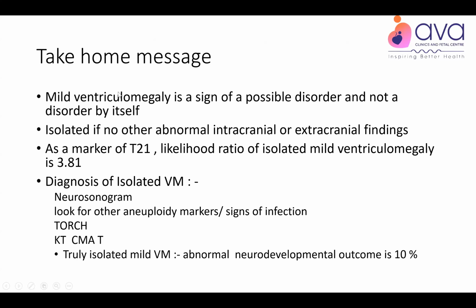So the take-home message from these two cases is that mild ventriculomegaly is a sign of a possible disorder and not a disorder by itself. It is isolated if no other abnormal intracranial or extracranial findings. As a marker of trisomy 21, likelihood ratio of isolated mild ventriculomegaly is 3.81.